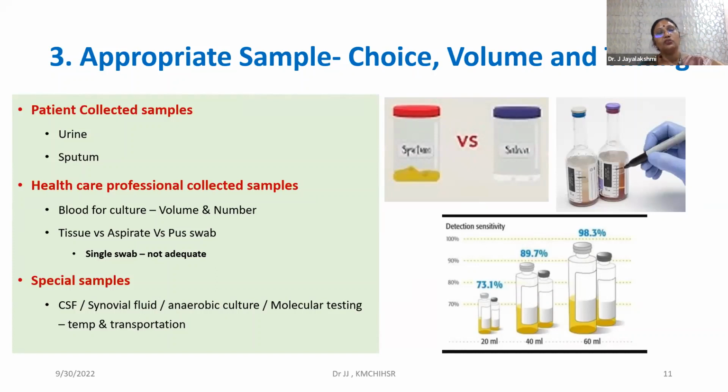Okay. There would be a huge surgical site infection with a gaping wound, etc., with purulent pus, but they will take a small nip of swab very close to the skin surface, and they will send one dried swab to the laboratory. So whenever a tissue is available, always ask for a tissue first, and then an aspirated pus would be a better sample than a pus swab. Pus swabs are a last alternative only.